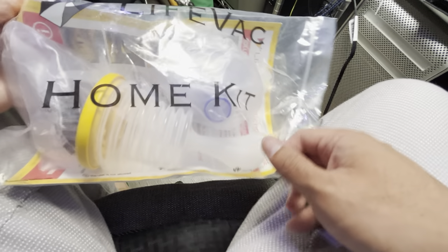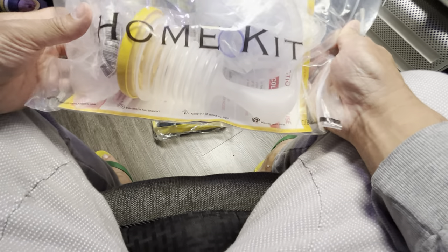Show me the goods. Today I'm going to be talking about the LifeVac Home Kit and we also have the Travel Pack.